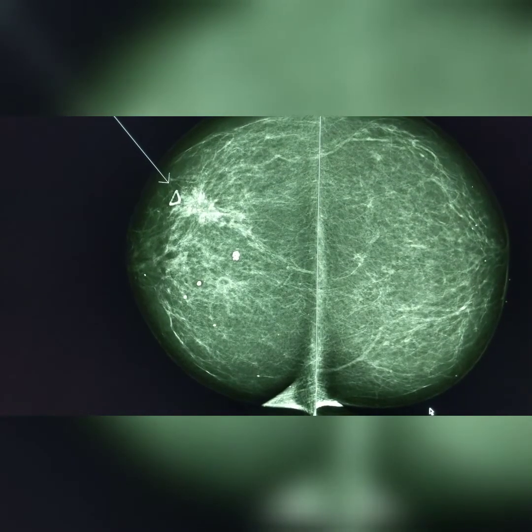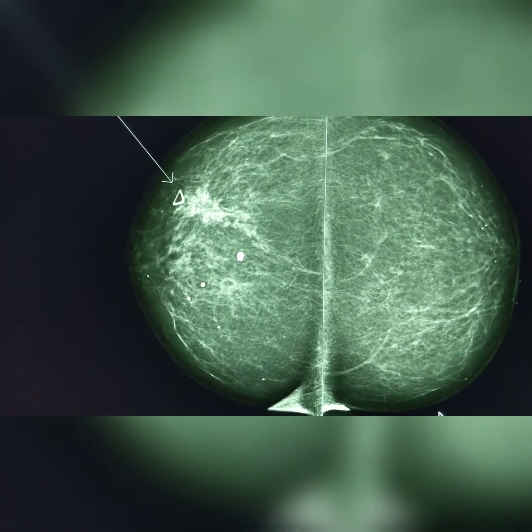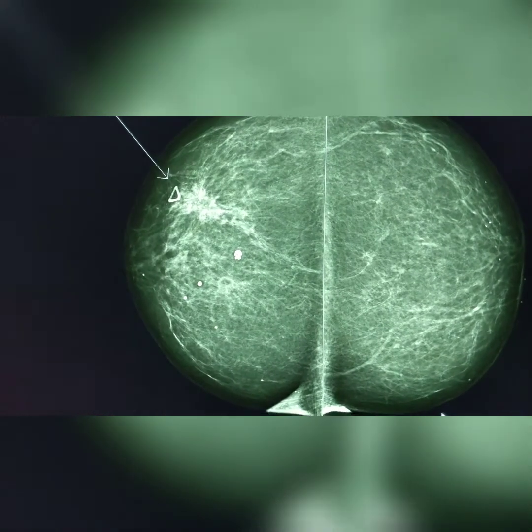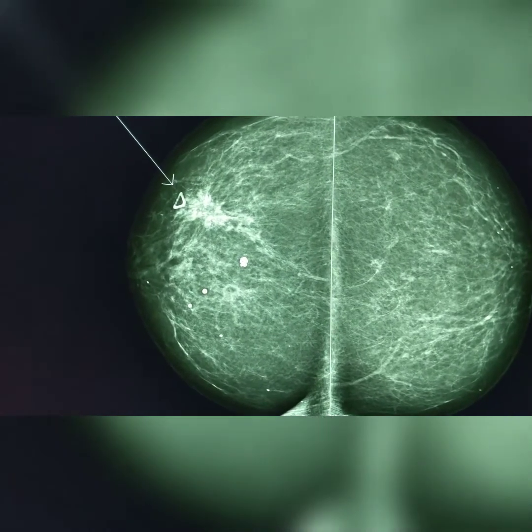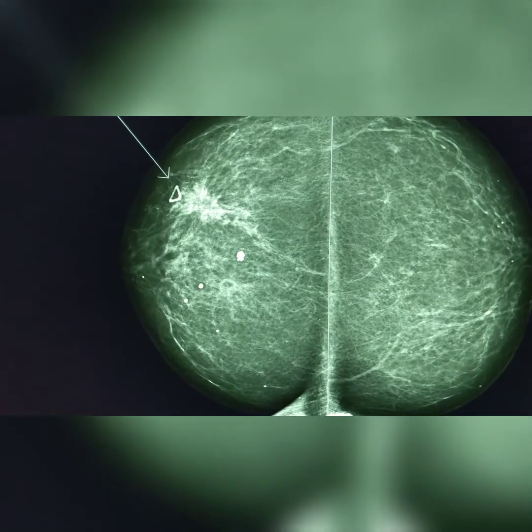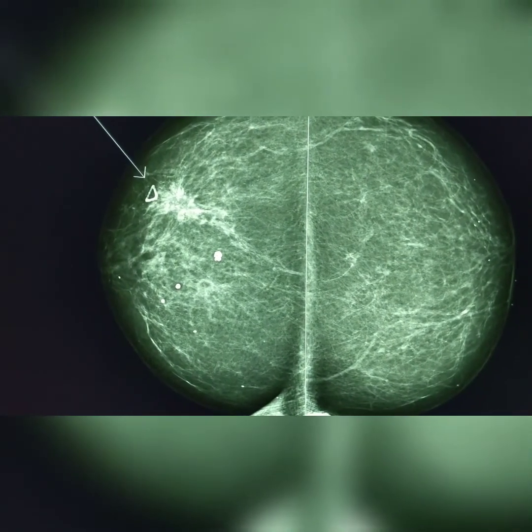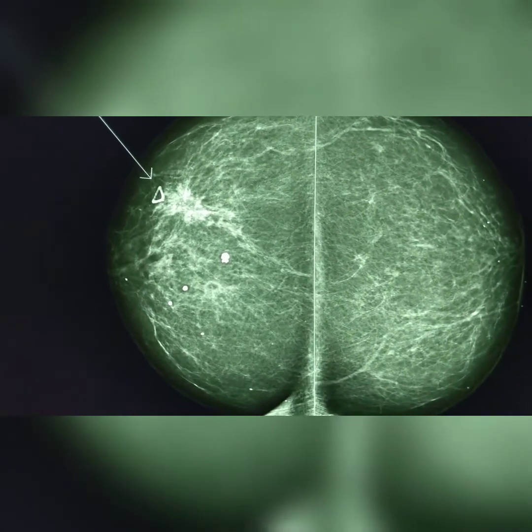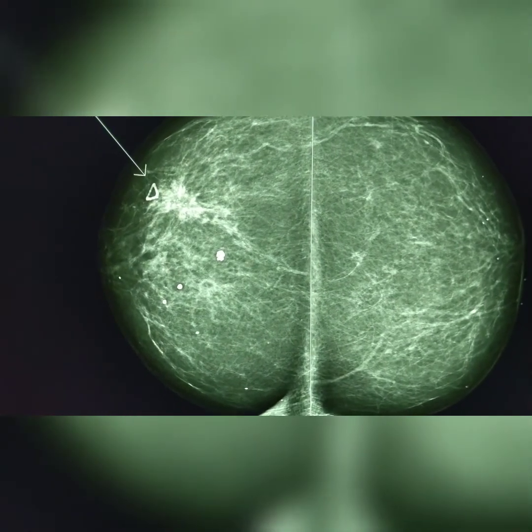Okay, so one of the first procedures I did today was an ultrasound guided breast biopsy. So we're going to start with the mammogram because that's what we started with for this lady. Typically with these kinds of things, somebody feels a lump in their breast. So that's why doing a self-exam and getting a clinical breast exam is important. And sometimes we find them on screening mammography. That's why people do screening mammograms in our country. And we find things like this.